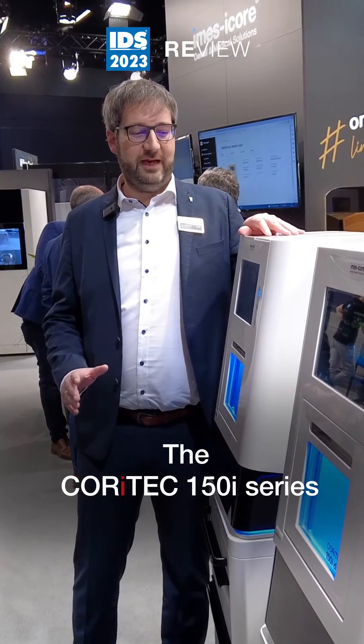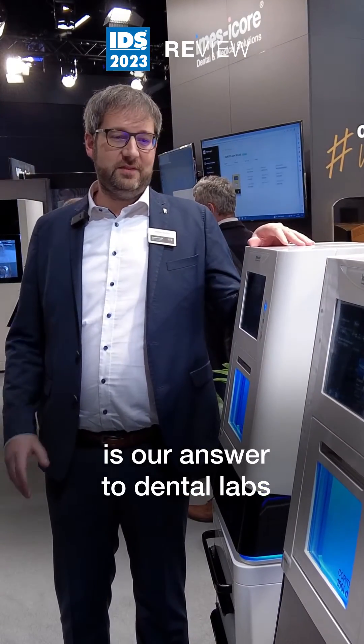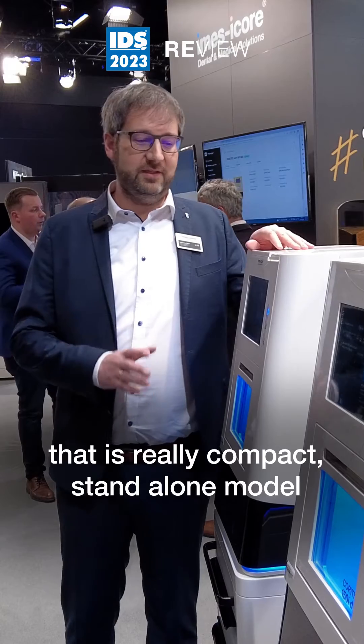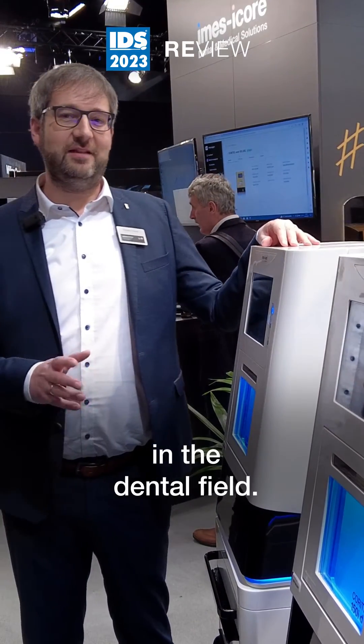The Coretec 150i series is our answer to dental labs that are looking for a machine that is really compact, a stand-alone model that is able to mill all major materials in the dental field.